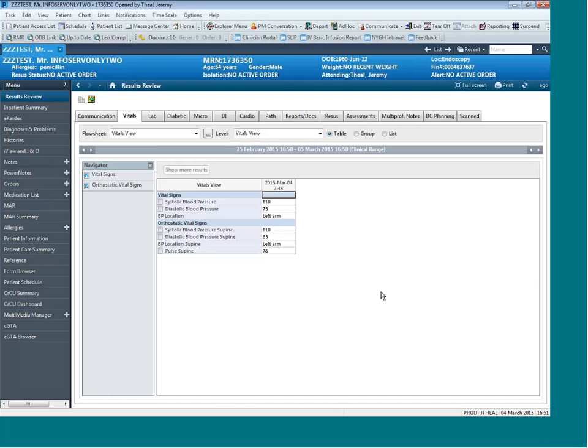both inpatient and outpatient. The goals of this project were to create an efficient workflow that helps the physician document in a timely fashion so that the notes will be completed and available as soon as the procedure is finished, automatically sent to referring physicians and consulting physicians immediately after the procedure is done, and also to build evidence and research and quality standards into the workflow so that it's easy for physicians to meet all the necessary quality standards.